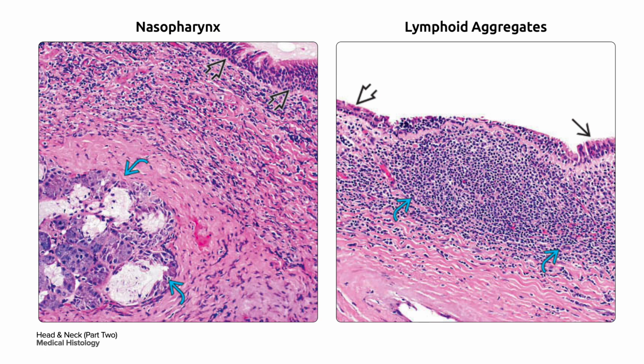On your left is the nasopharynx, which is lined by both ciliated respiratory type epithelium and stratified squamous epithelium. The pharyngeal tonsil roof and anterior regions are lined by respiratory type epithelium in bold black arrow. Numerous submucosal mixed seromucous minor salivary glands are present in curved blue arrow.